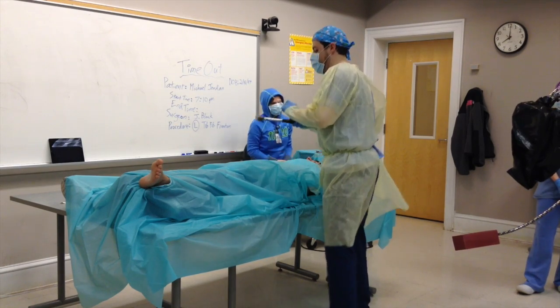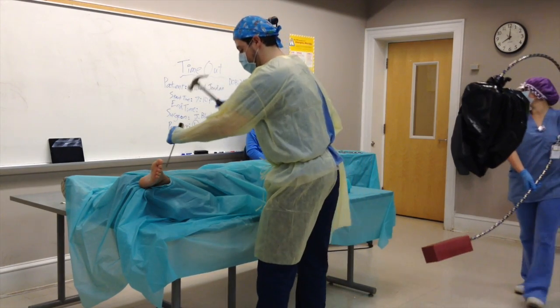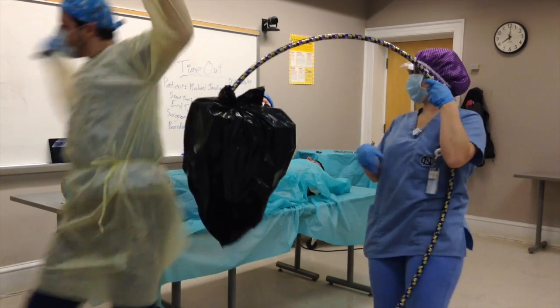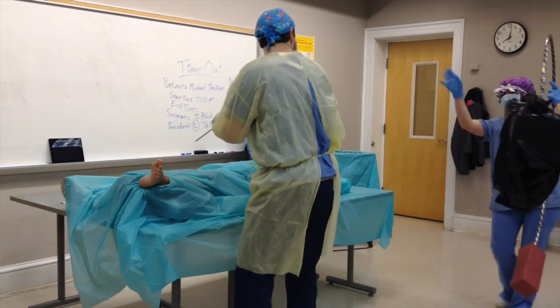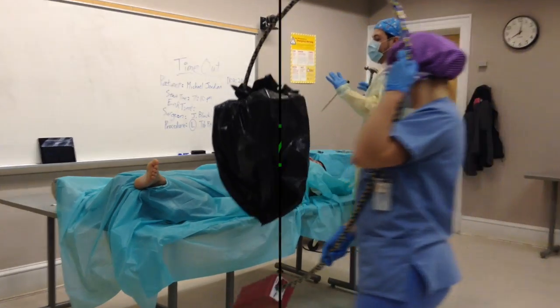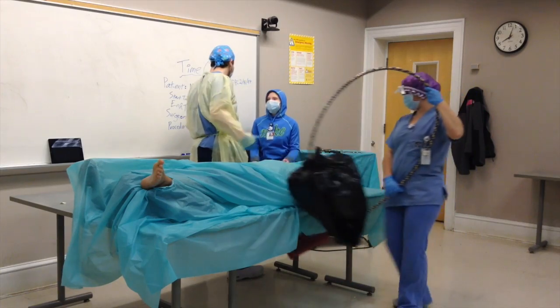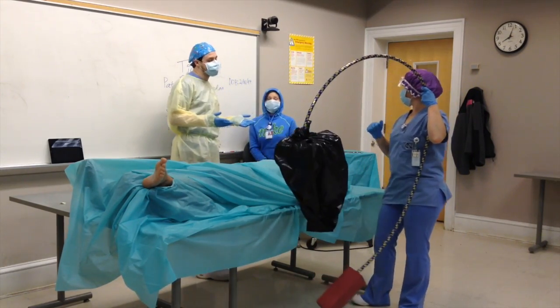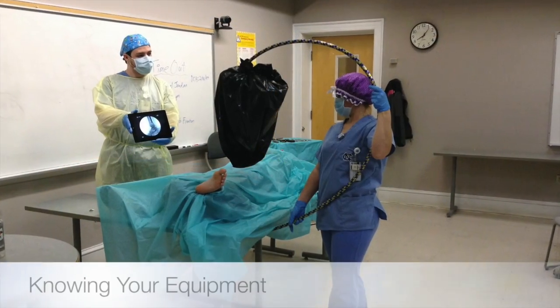Communication is also very important when maintaining the sterile field. Always let the surgeon and nurse know when you are moving and walking behind those who are sterile. This helps prevent accidental bump-ins that break the field. Another part of communication is being honest and not afraid to speak up if you think the field has been broken.